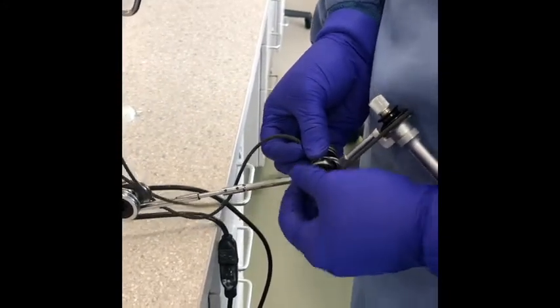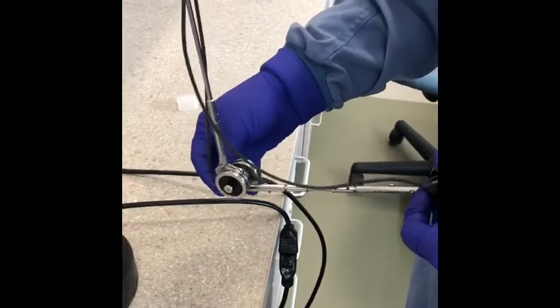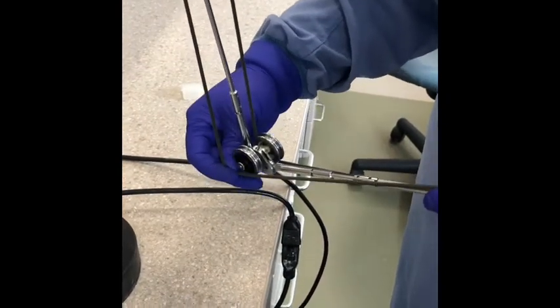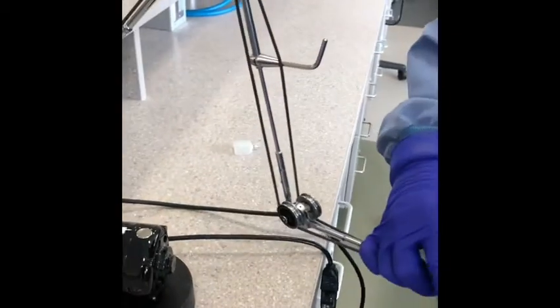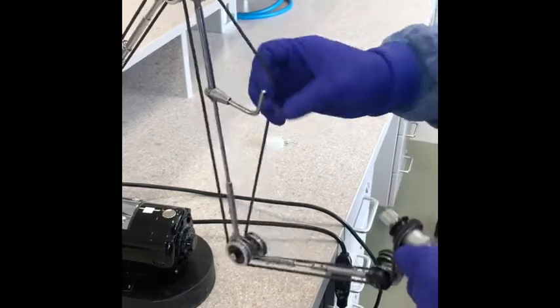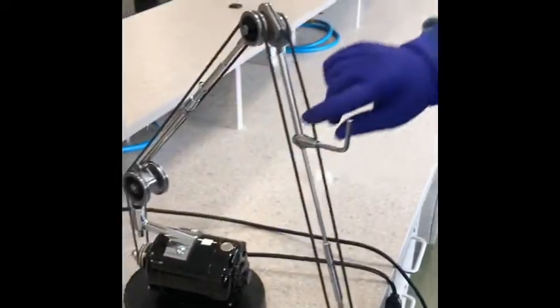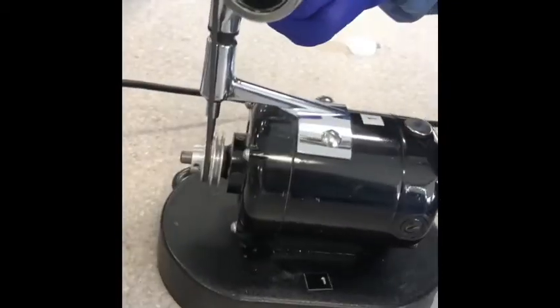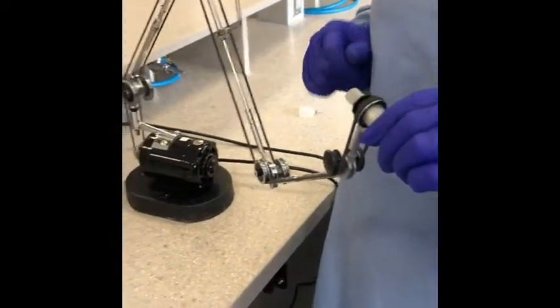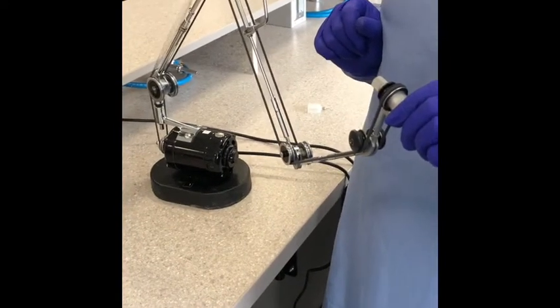So sometimes you have to just hold the rope until it gets the resistance to stay in place on its own. And then you go under on the last one here. Okay, then you just double check to make sure everything's in line. So again, you make sure you're on the outside, make sure you're not crisscrossed over any of the areas here. So on the inside, under, under, then here we go over, over, and then we're on the outside on the back part. Then you always check it with stepping on the rheostat slowly at first, just to make sure that everything looks good and it's not gonna get caught or fly off of the joints. So it looks good.